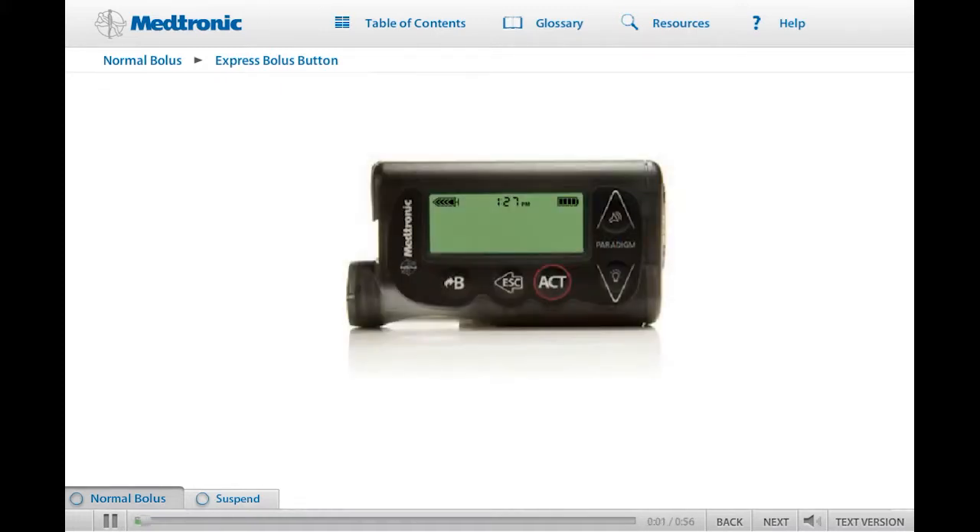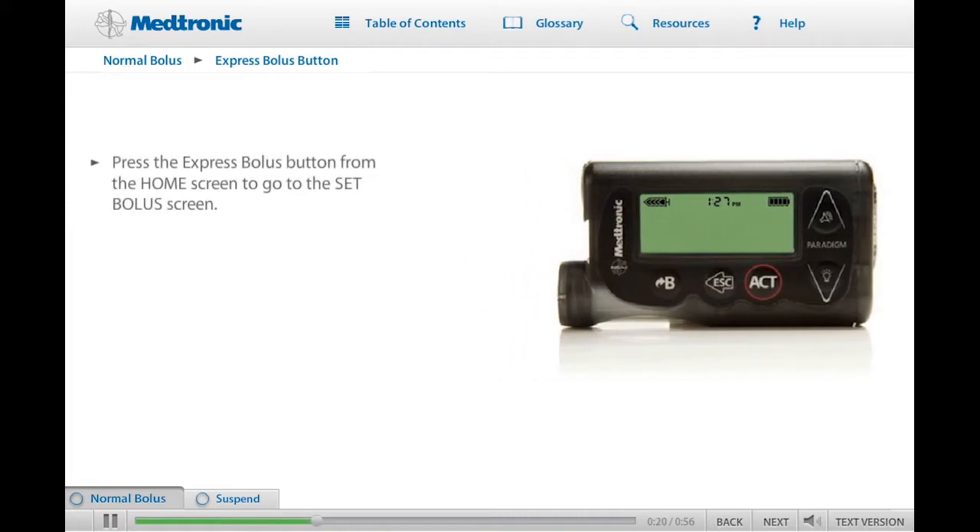Now that you've learned the basics of giving a bolus, let's look at the Express Bolus button on the left side of your pump. The Express Bolus button is a shortcut to the Set Bolus screen and is probably the button you will use most often when giving a bolus. When the Express Bolus button is pressed from the Home screen, it takes you directly to the Set Bolus screen. You can practice delivering a bolus using the Express Bolus key now, if you like. Remember, you should not be connected to your pump while you practice.